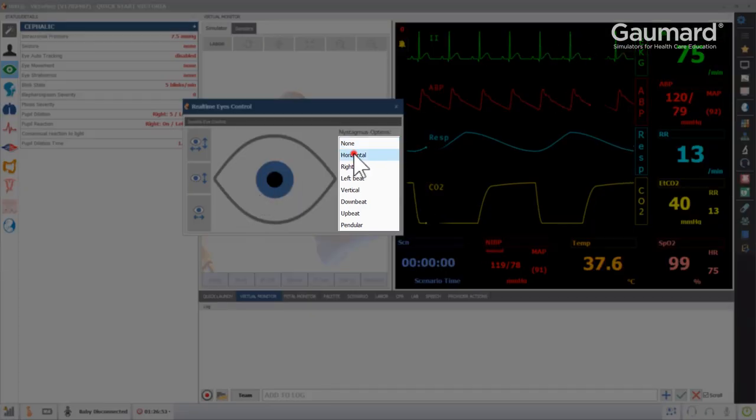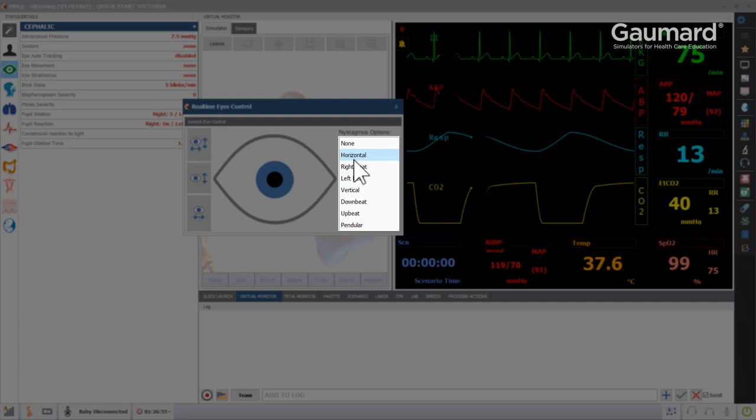On the right side of the panel are options for nystagmus. Simply click one of the options to apply it to the eyes.